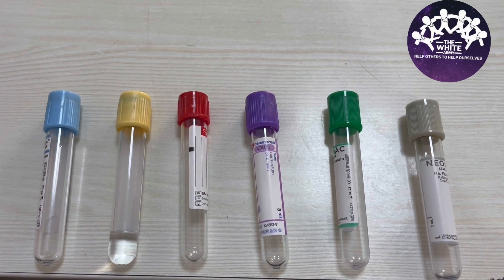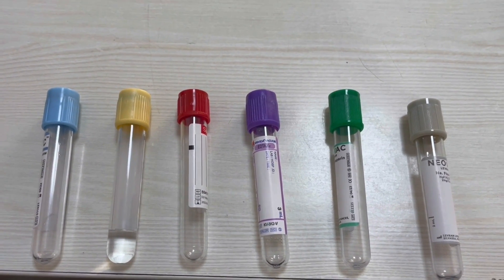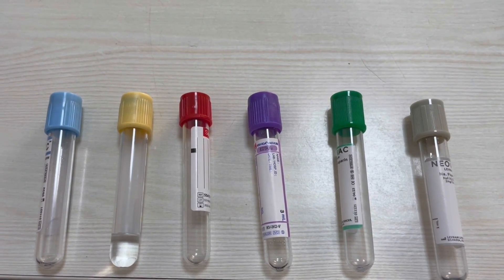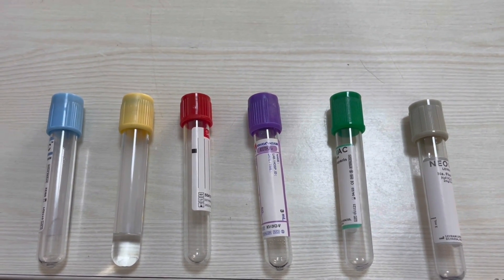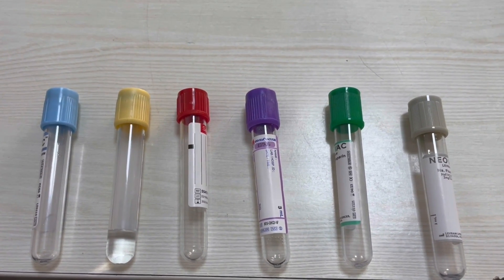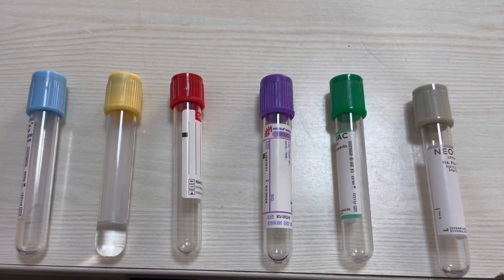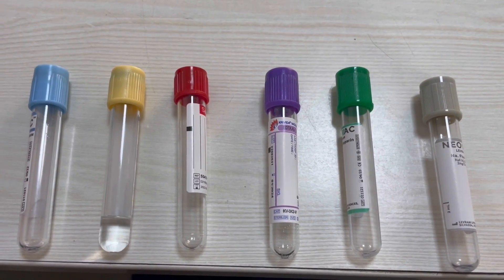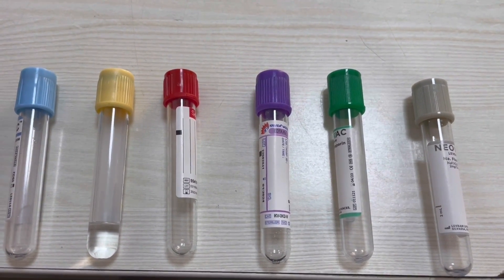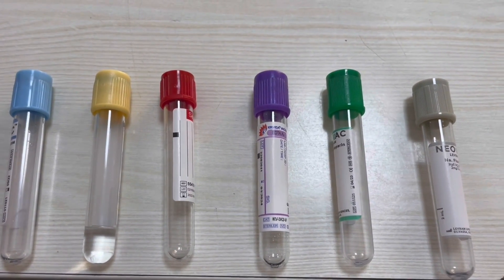This video is going to be on an important skill we have to pick up during internship: drawing blood into different vacutainers. It is essential to know what these different colors of vacutainers mean and what investigations they will be used for. We also need to know the order of draw — when collecting blood samples with a set of investigations, you should know in what order you will be drawing those samples.